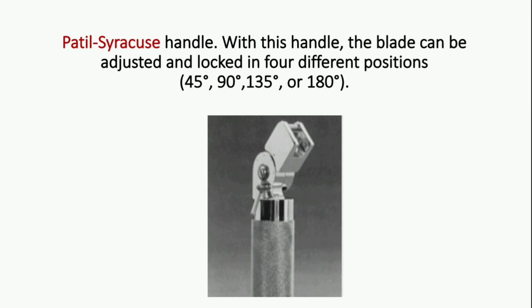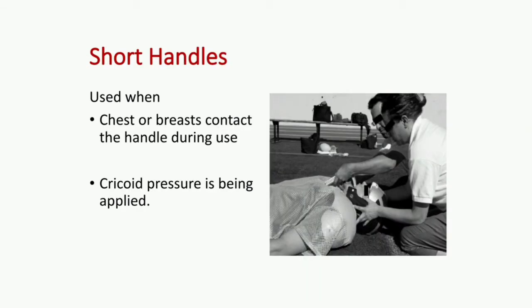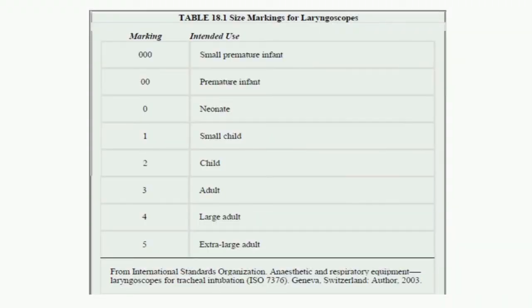The Padil Syracuse handle is a special type of handle in which the blade can be adjusted and locked in four different positions: 45 degrees, 90 degrees, 135 degrees, or 180 degrees. The handle comes in different lengths; short handles are particularly useful when the chest or breast contacts the handle during use.